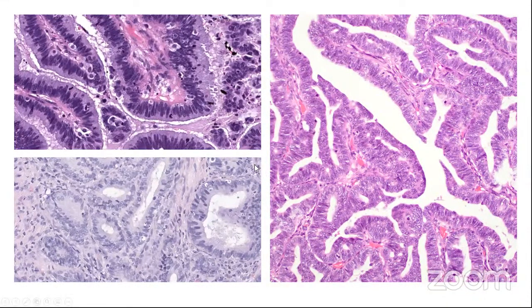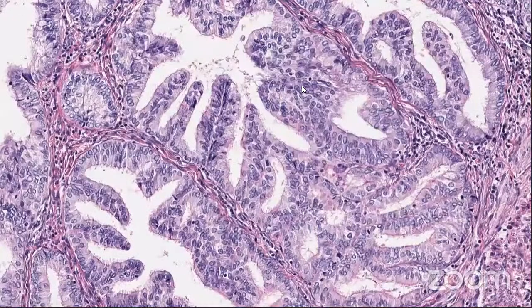As I mentioned in the IECC, what you want to look for are easily identifiable luminal mitoses and lots of apoptotic bodies. And here on the right, very often what I notice with cervical adenocarcinomas are these very pointy tips of the villi, as opposed to the very well-rounded tips of endometrioid tumors, as you can see here. And that's just a soft criterion, it's not absolute, but this is a nice case of a true endometrioid tumor with ciliated or tubal metaplasia.